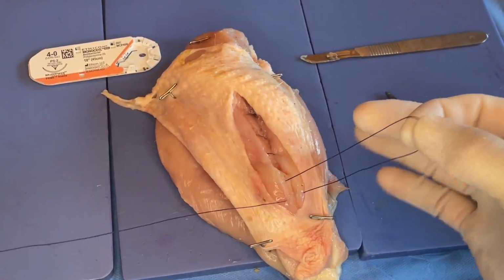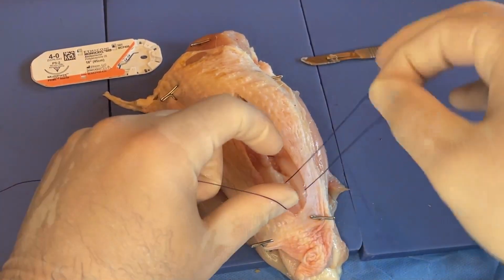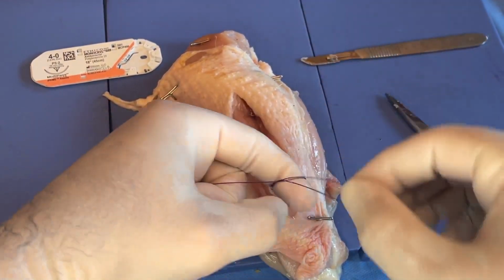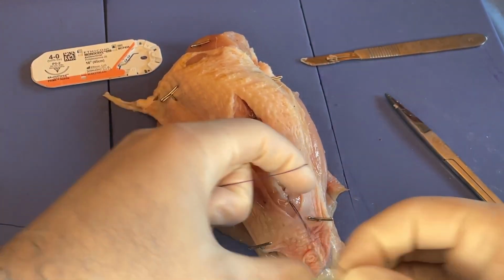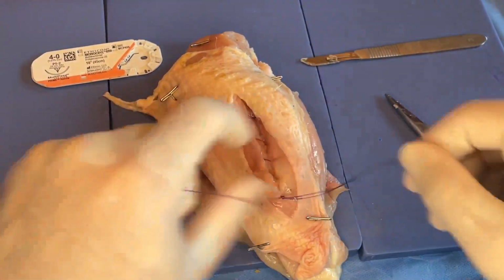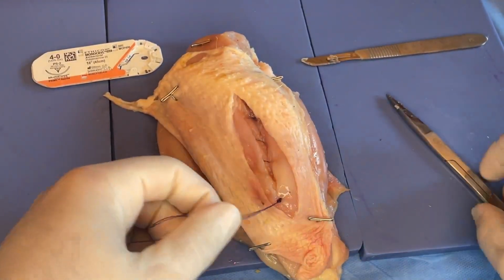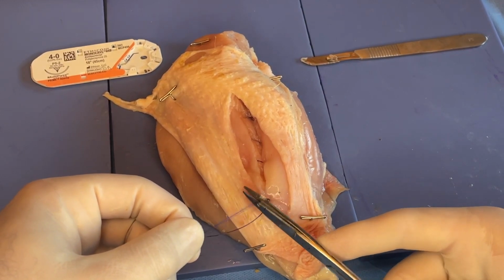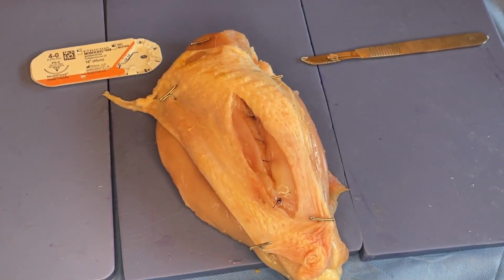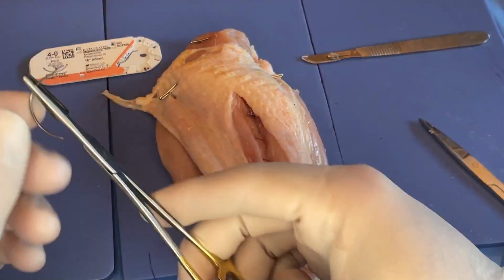So again, because we've been doing this running, we have a loop here and a single strand. So we just kind of treat the loop as a single piece of suture. Over thumb, cinch that down, over finger, over thumb, over finger. So that's 4 throws, 2 complete square knots. We'll cut this kind of short just so it doesn't poke up through the skin. Scissors are losing their sharpness.